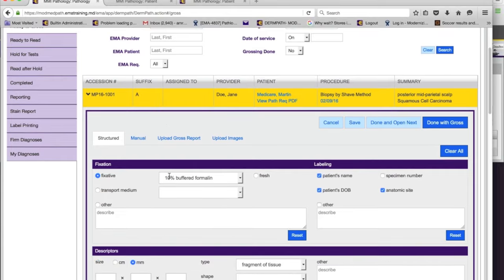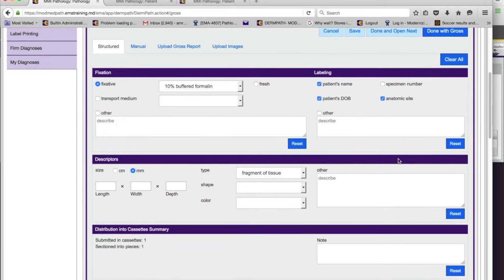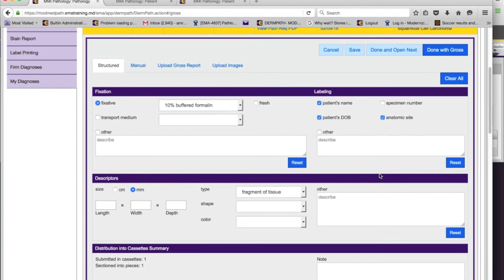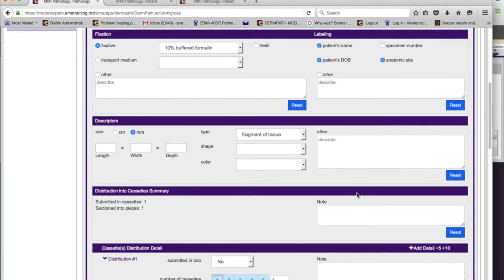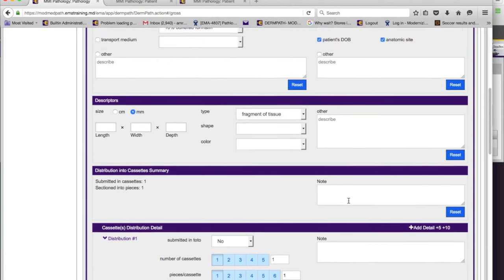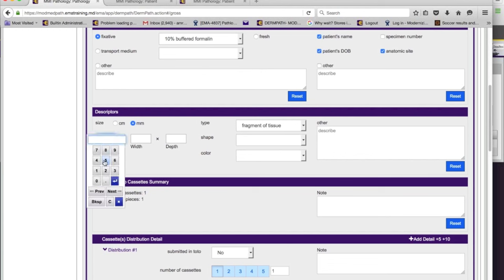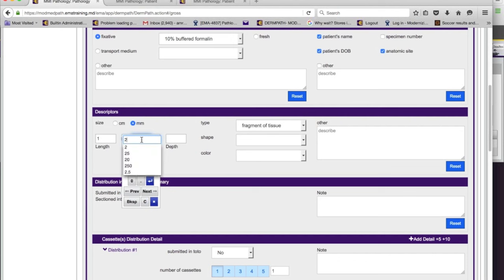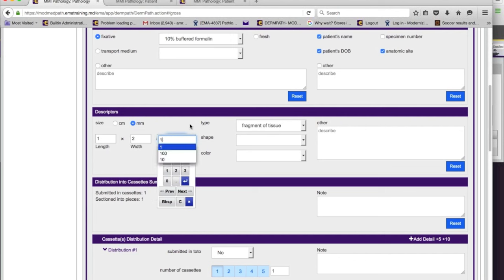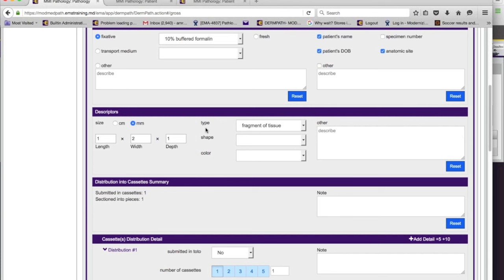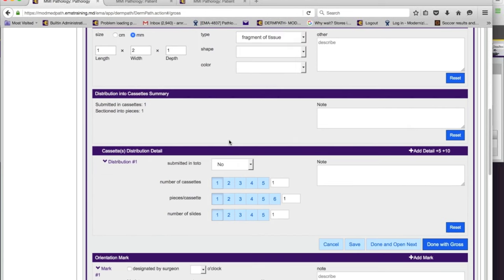When you gross, you open the case. You'll notice some items are pre-selected, which comes from the default screen I touched upon — all of this is optional. You pick the things you want to fill: fixative, descriptors, size — you can use the widget we provide, type it in, or even dictate with Dragon if it's installed on the machine. You also tell us how many cassettes, how many pieces per cassette, and how many slides per cassette — also pre-populated from defaults. You can always add additional cassettes.